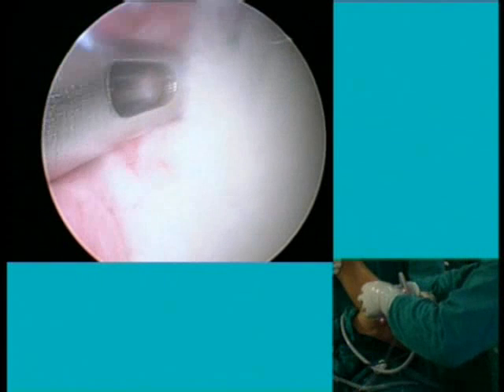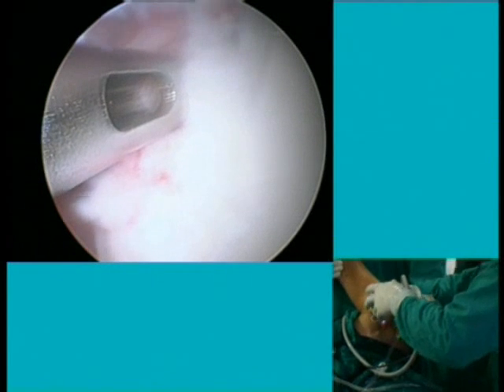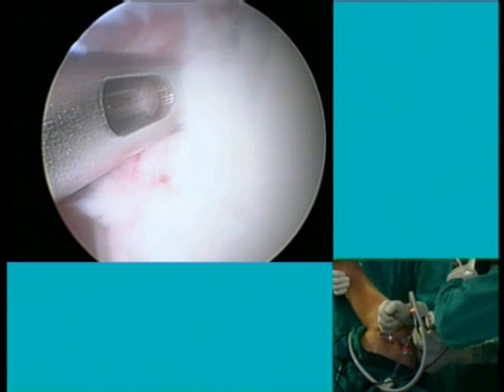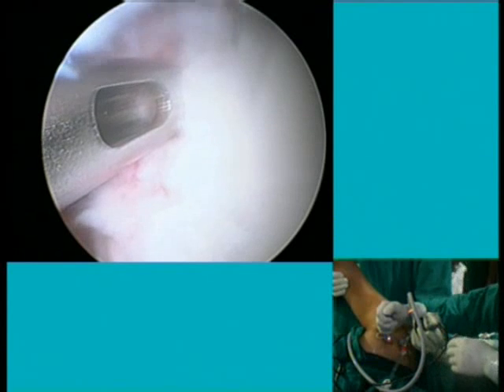Okay. Is the drill ready now? Yes, it looks like a pretty good view here. Drill ready? One minute. Okay. We are running in this.